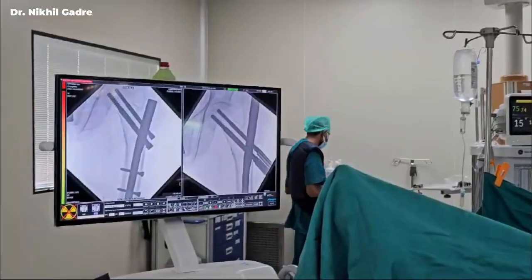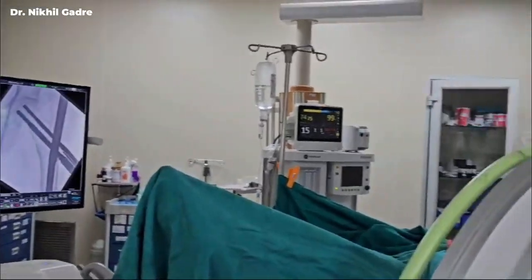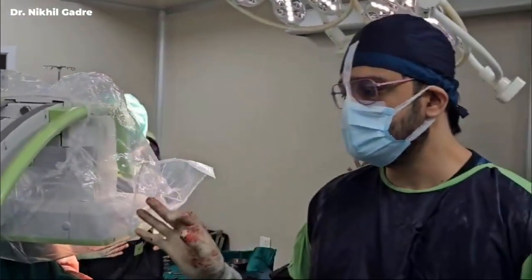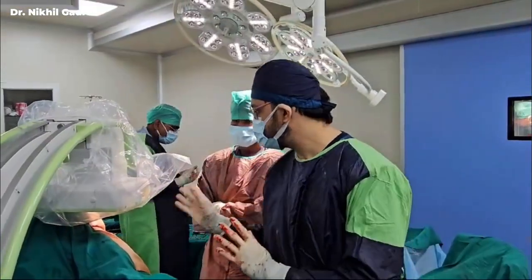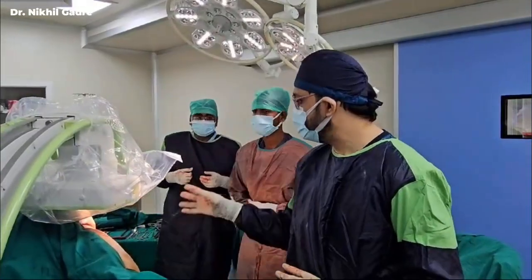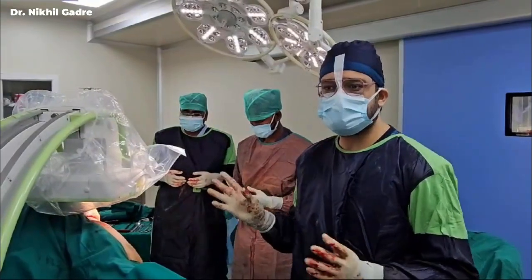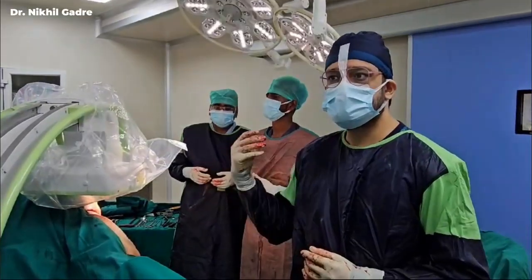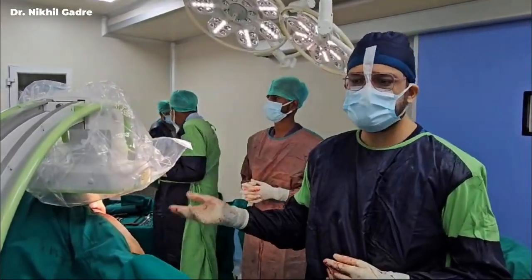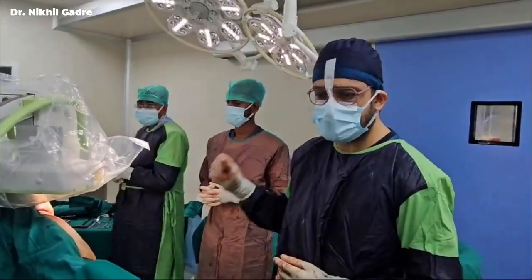And this is what we call a picture perfect X-ray. This patient, God willing, will have an excellent outcome, and she can be full weight bearing without support in about 2 months' time. Now is the start of the closure. We'll give a wash of around 3 liters to prevent any perioperative chances of infection, and then take stitches. We'll start from the deepmost layer of TFL, then subcutaneous, and then skin, which my assistant, Brother Sachin, will take.